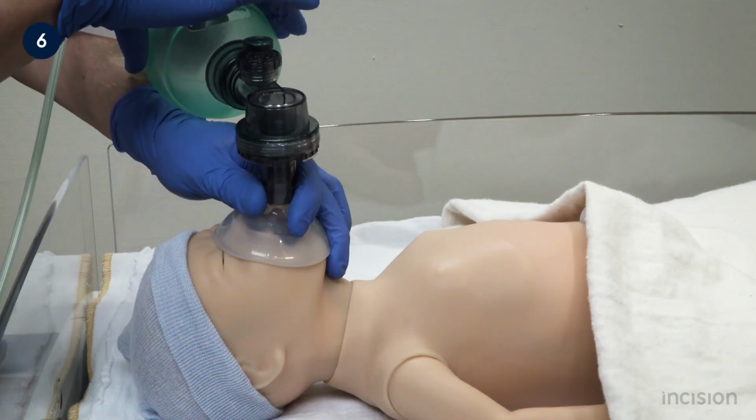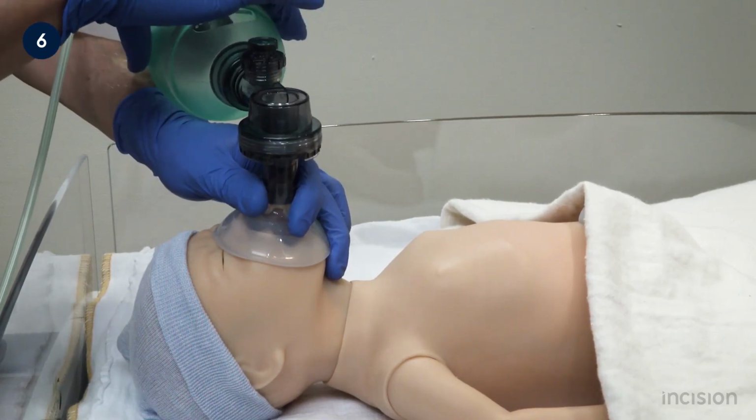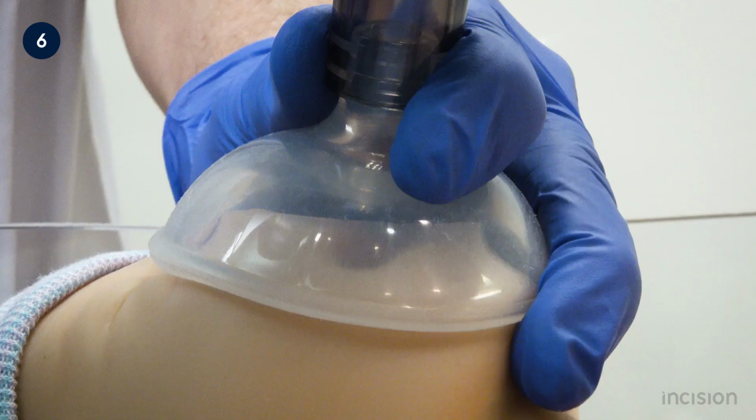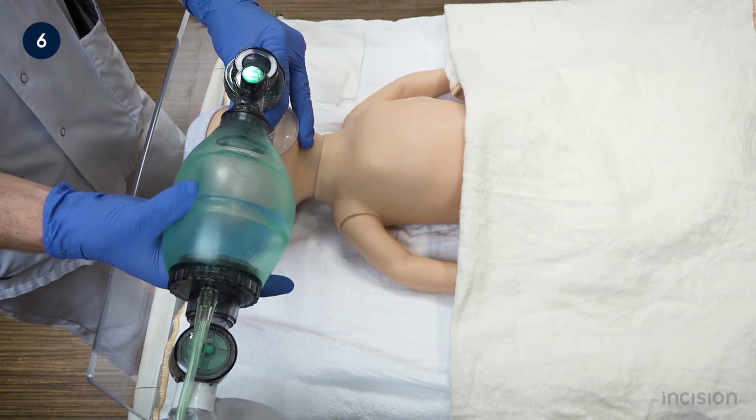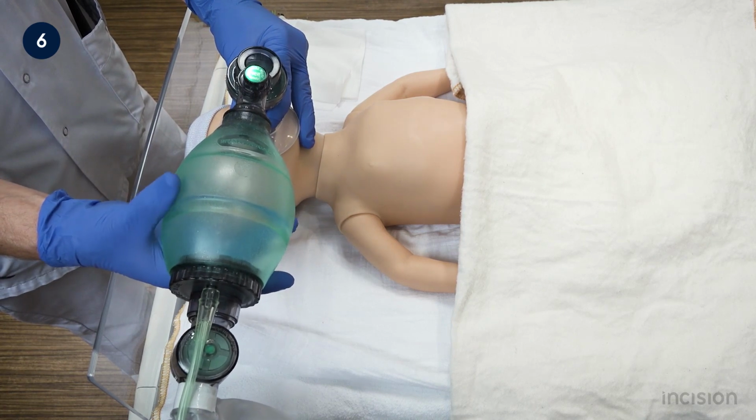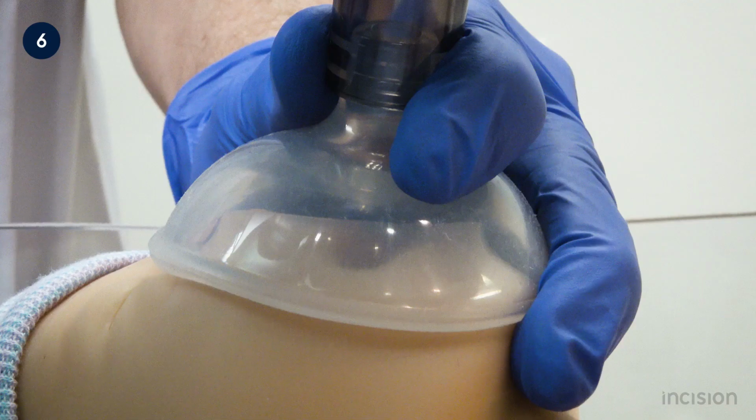In cases of home delivery, a self-inflating bag and blow-off valve set at 30 to 40 centimeters H2O can be used. The oxygen level is set to 21% and may be increased if necessary. After 30 seconds of ventilations, the condition of the neonate is reassessed. The result of this assessment determines the next step.